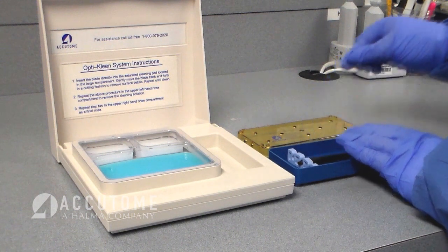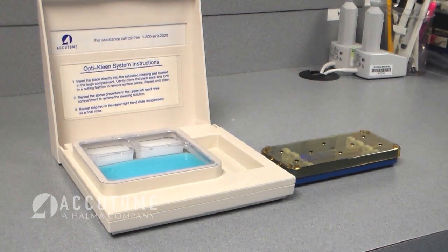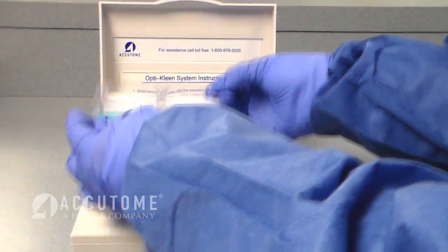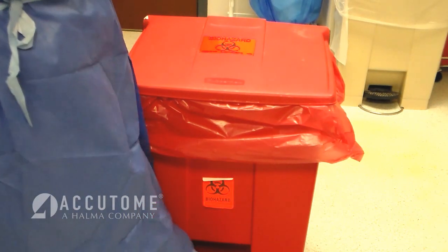The OptiClean blade cleaning system can be used throughout the day for both diamond knives and delicate instruments. Each new instrument should be cleaned in an area of the pad that has not already been used. At the end of the day, the OptiClean blade cleaning system is simply disposed of according to your local regulations.